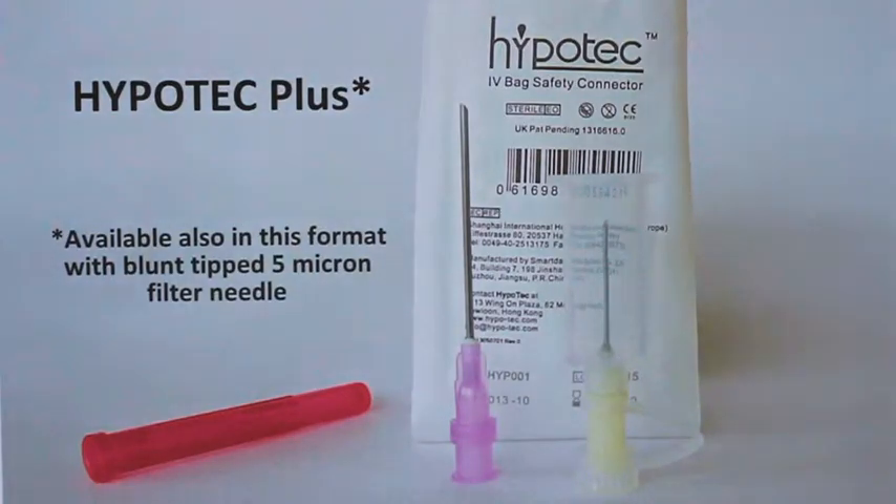Hypotec Plus is a natural extension to the original Hypotec product, now available with a blunt tipped 5 micron filter needle, all within the one handy pack.